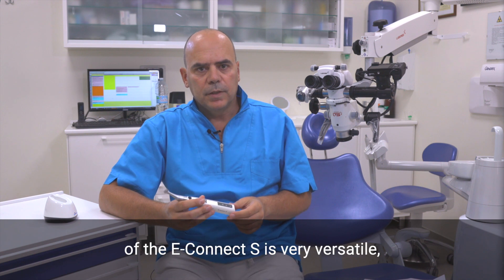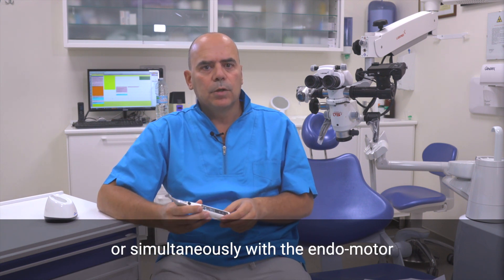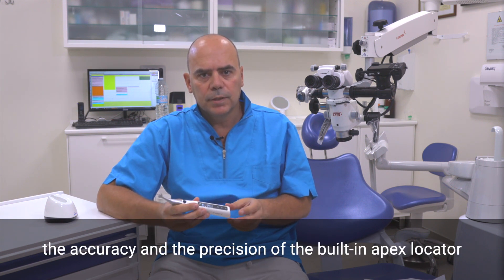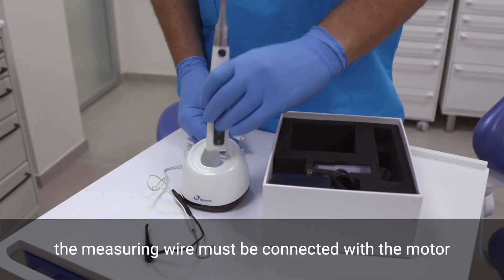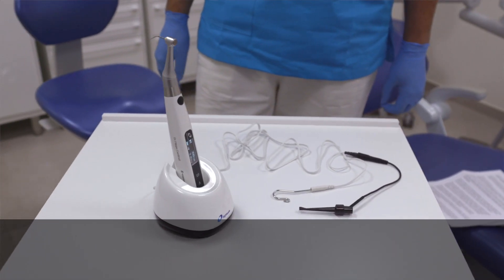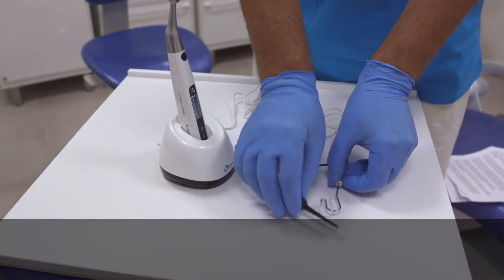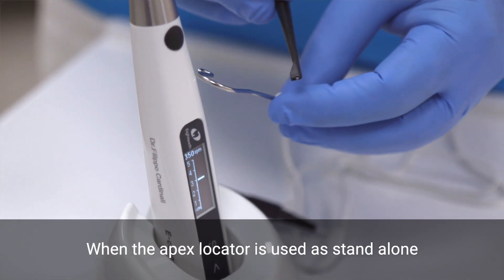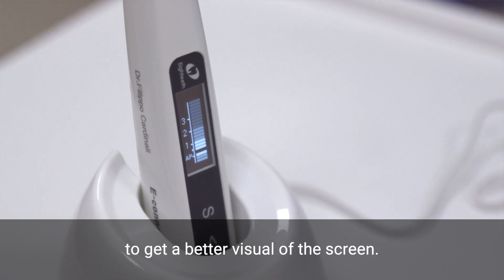Even the built-in Apex Locator of the E-Connect S is very versatile. It can work as standalone or simultaneously with the handpiece motor, depending on operator preference. Thanks to the multi-frequency technology, the accuracy and the precision of the built-in Apex Locator is really very high. To use the Apex Locator, the measuring wire must be connected with the motor by the USB socket present in the back side of the MTS. A tip to check if it is working properly is to activate the rotation and then touch the file with a lip hook and check that all the bars on the screen light up and that the motor reverses the rotation. When the Apex Locator is used as standalone, it is better to place the handpiece in the charging base to get a better visual of the screen.